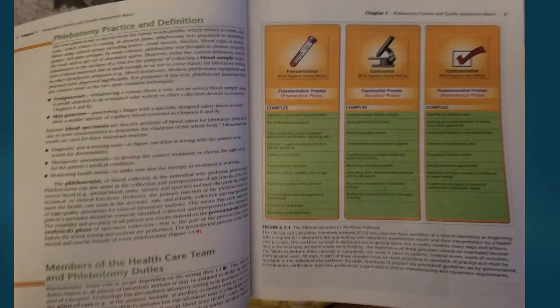The reliability and accuracy of all patient test results depends on the pre-examination or pre-analytical phase of specimen collection. That is, the part of the process that occurs before the actual testing and analysis are performed. The pre-analytical process is the fundamental and crucial domain of every phlebotomist. See Figure 1.1. Members of the healthcare team and phlebotomy duties.